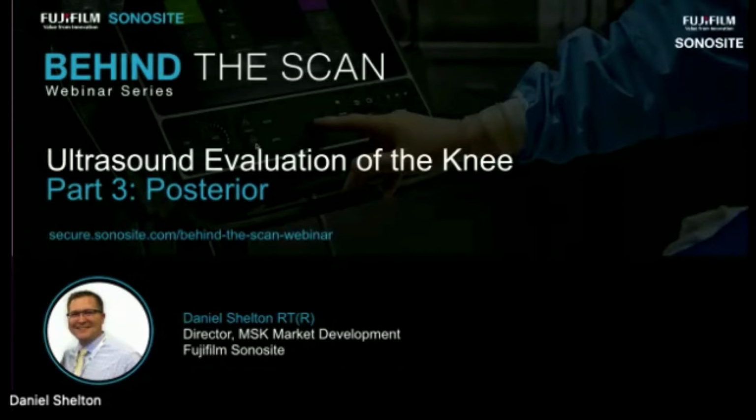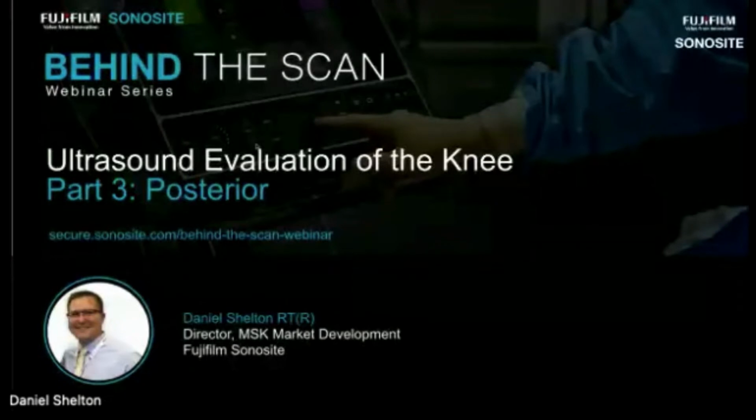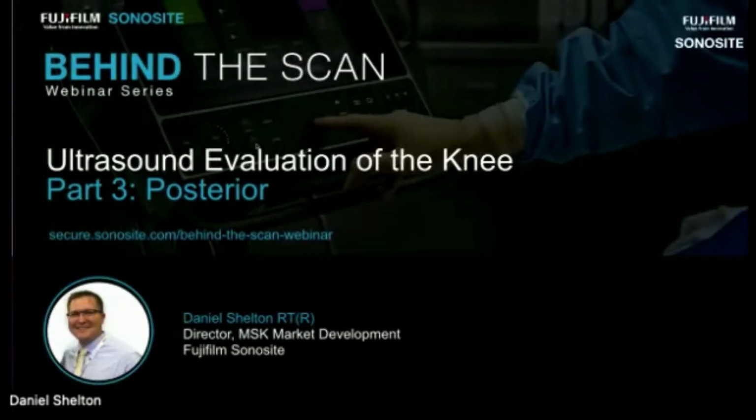All right, thanks, Laura, and thanks everybody for joining us. This is part 3, so if you haven't attended the anterior knee, which included the suprapatellar structures and infrapatellar structures, and then part 2 was medial and lateral structures like our collateral ligaments, iliotibial band, etc. And now we're going to wrap it up on the basic knee evaluation on the posterior knee, where we talk about Baker's cyst, anatomy, neurovascular structures, and then we'll wrap up some of that anatomy that we left off on the lateral knee, where it kind of tapers in with the posterior structures like biceps femoris and the common peroneal nerve. So we'll go ahead and get started on the Baker's cyst anatomy first.